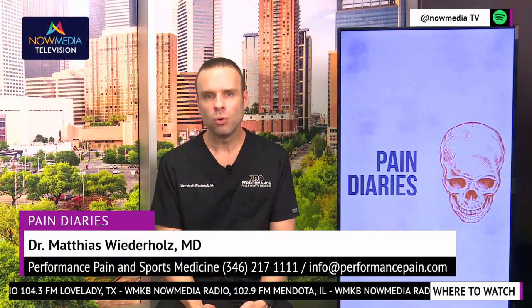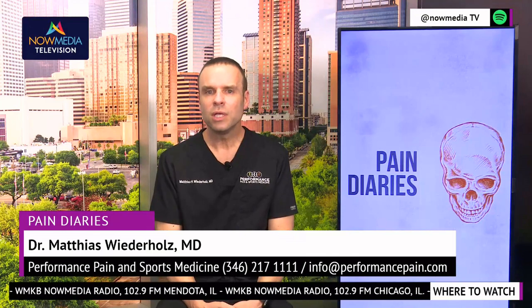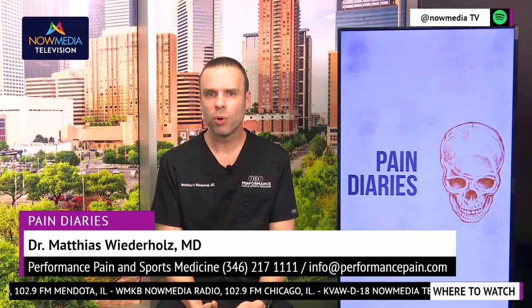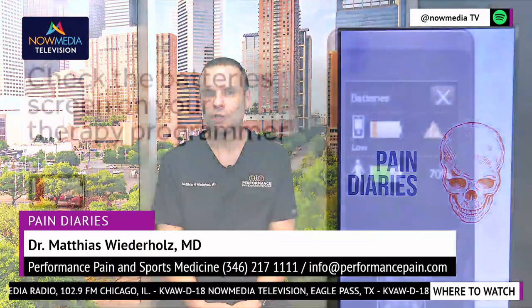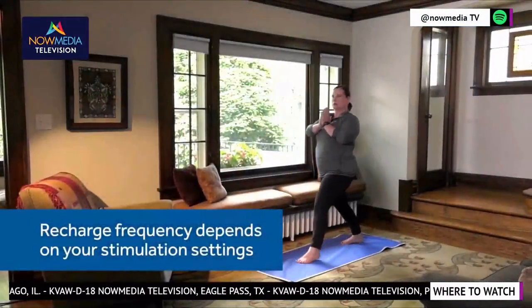Once everything is healed and you've followed those restrictions and the therapy's working for you, there are very few restrictions. You can go in the pool, you can go to the lake, you can submerge. There really aren't significant restrictions. You will want to let them know at the airport that you have a medical device like any other pacemaker or other device, and you'll go through that special line at security. Other than that, there really aren't a whole lot of restrictions with the Medtronic system.